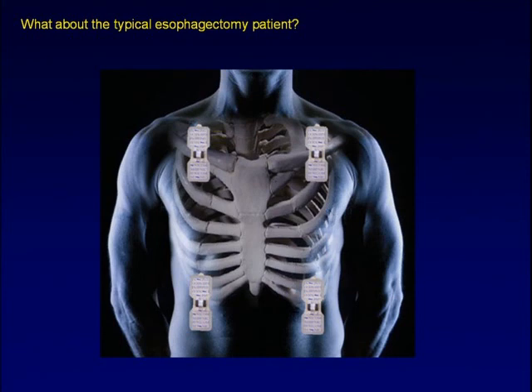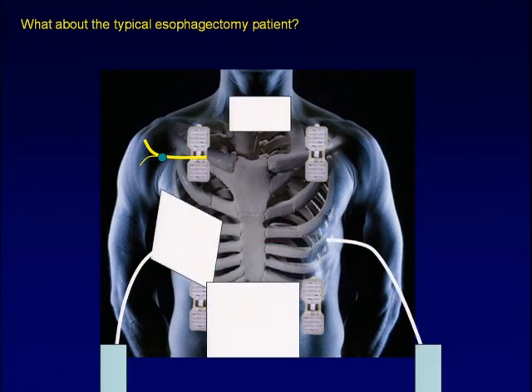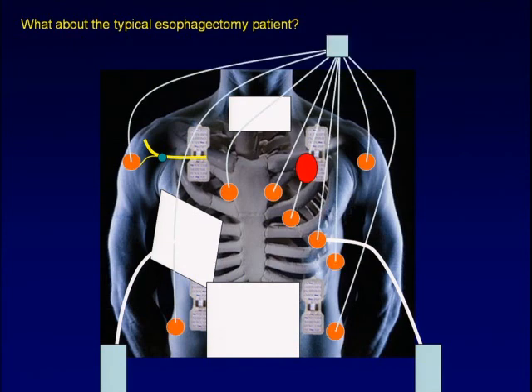And if we take the description of how the leads are placed, and we say, well, actually, the patient may have a subclavian line. They're going to get an incision in their abdomen and their chest and in the neck, and they're going to have a chest tube on one side and a chest tube on the other. They're going to have bandages put over all these things, and a lot of the patients have an AICD pacer, and then they're going to go to the unit and they're going to have leads put all over them. How practical is it with this array of electrodes?